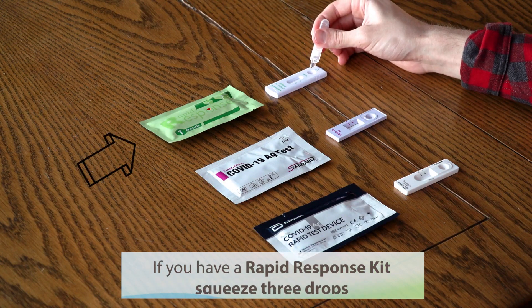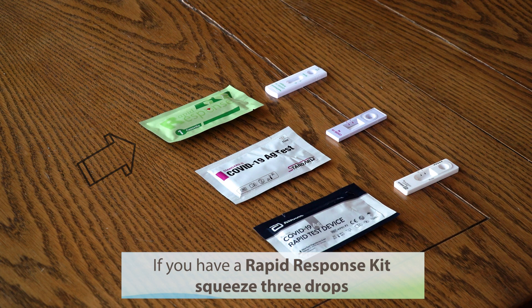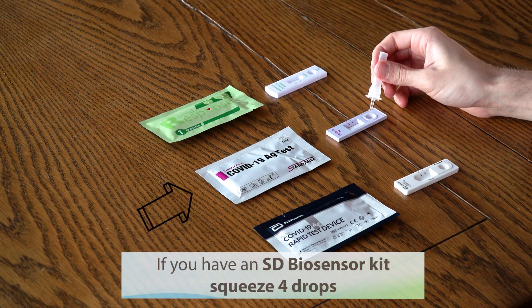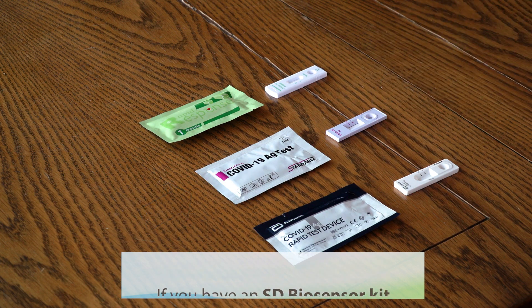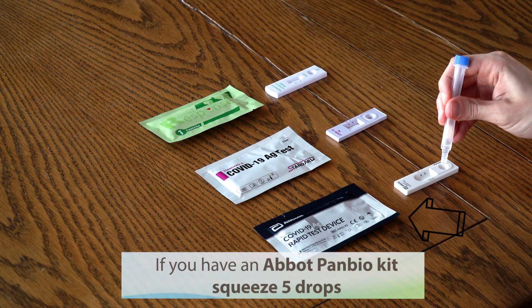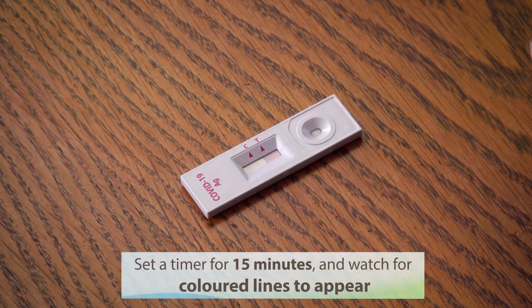If you have a Rapid Response kit, squeeze three drops of the liquid into the sample well of the testing device. If you have an SD Biosensor kit, squeeze four drops. If you have an Abbott PanBio kit, squeeze five drops. Set a timer now for 15 minutes.